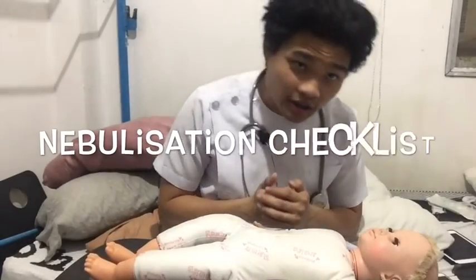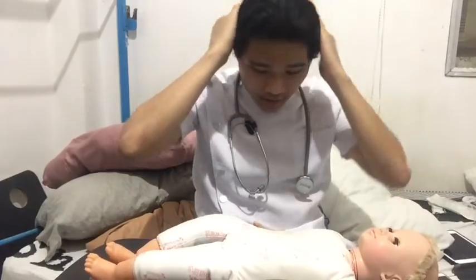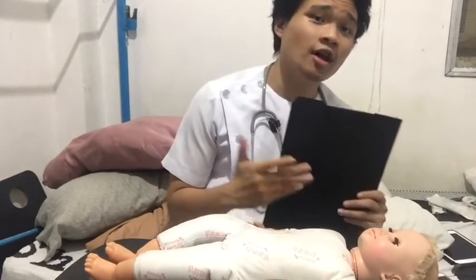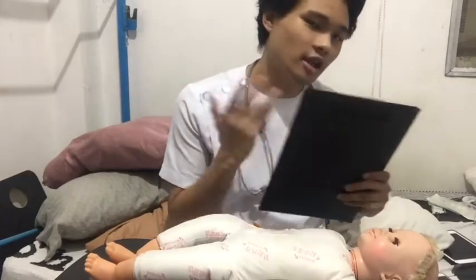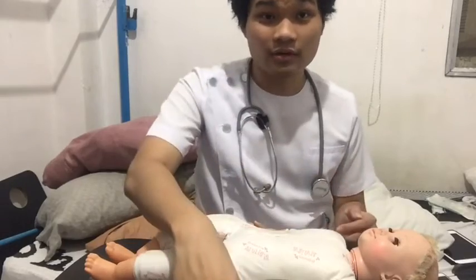And for the next checklist, what we are going to be doing is the nebulization checklist. First and foremost, we're going to be checking on the doctor's orders. The purpose of this is to know what medication we are going to be giving to the baby. And after checking on the doctor's orders, we're going to have to verify the baby with the client.